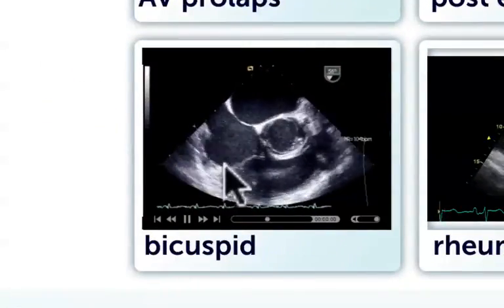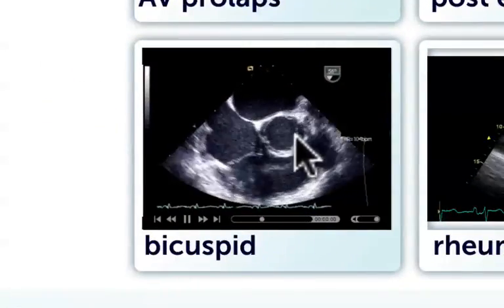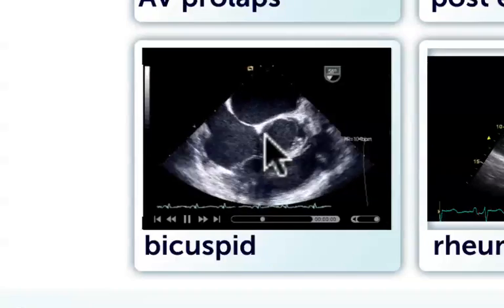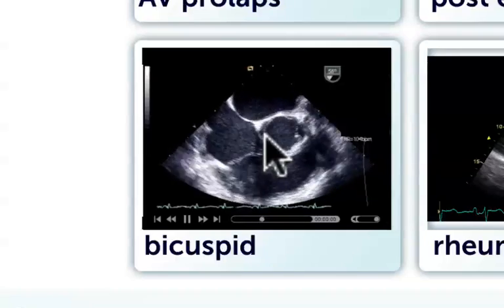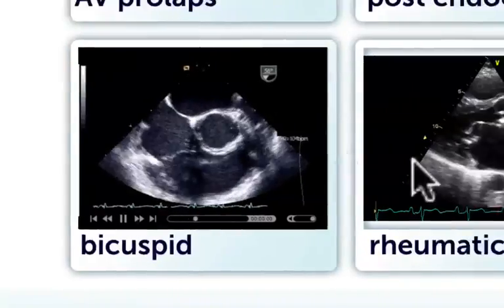Here we have a patient with a bicuspid valve. There are two cusps, one here and one here. These patients also have regurgitation very commonly, as we will see in the next slide.